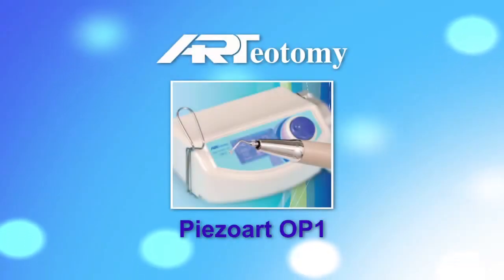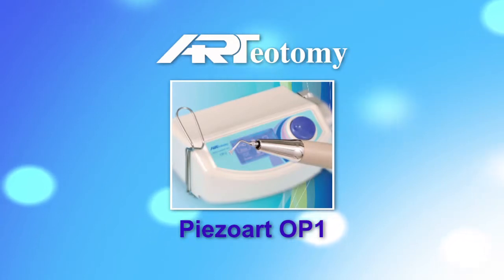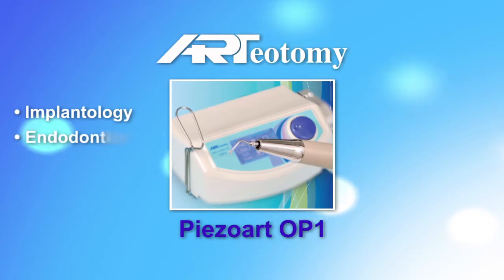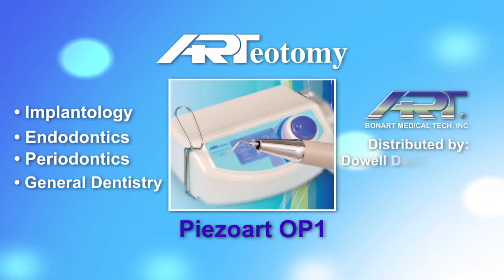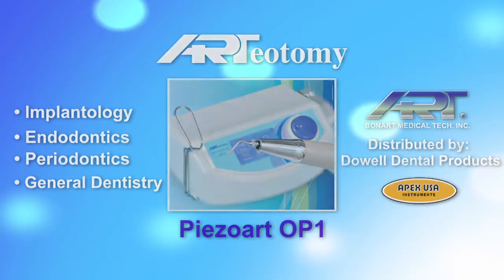Introducing the Ardiotomy Piezoart OP1, the most advanced and cost-effective piezoelectric ultrasonic surgery system available for implantology, endodontics, periodontics, and general dentistry. Manufactured by Bonart Company and distributed by Do Well Dental Products, doing business as Apex USA Instruments in the United States.